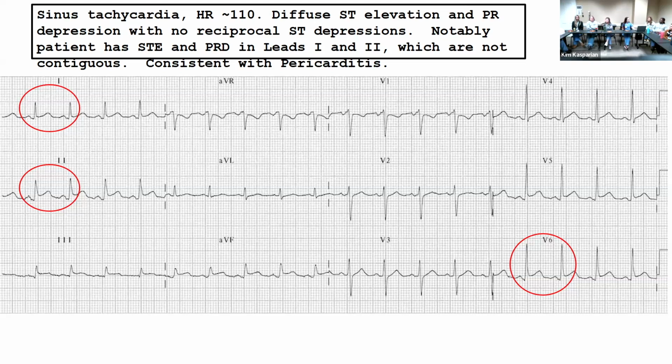You know, I actually have a question. So I got a call one night on a cross-cover patient, and it was actually Dr. Pog, one of the cardiologists, the one that reads all the EKGs. He called about a patient, and of course, the machine was reading the QTc interval incorrectly, but he made a comment too that the magnesium level was extremely low, and that would affect the QTc interval as well. He was telling me that the QTc interval was affected by the low magnesium.